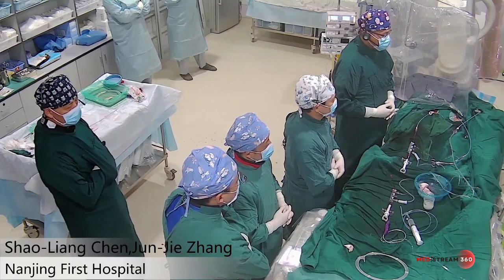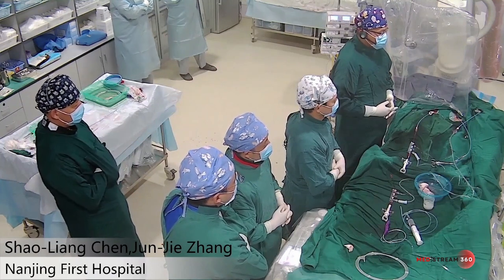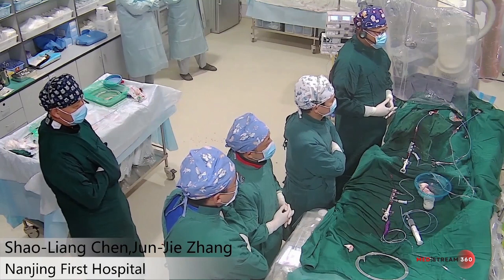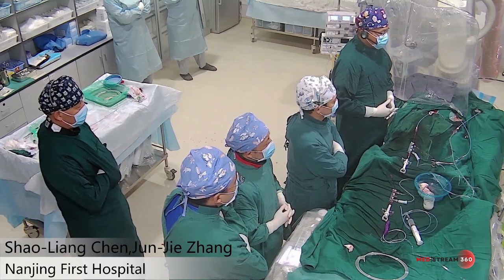Good morning, all friends. So this is our second live case this morning. We just finished one very complex PCI for distal left main trifurcation lesion. Now it's time for the TAVI case.